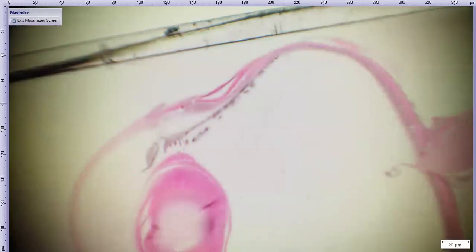So this is a pelican. And there's nothing special about it being a pelican, except that it's a nice, well-sectioned, anatomically correct representation of a bird eye. And we can see a lot of the same things we already talked about. Here's the pectin oculi. Now you can see once again the annular pad of the lens.